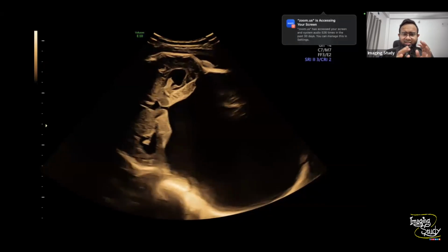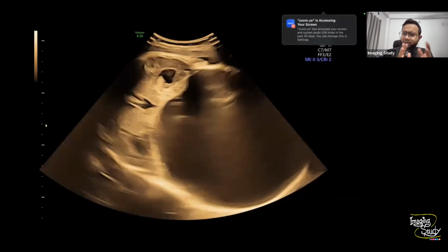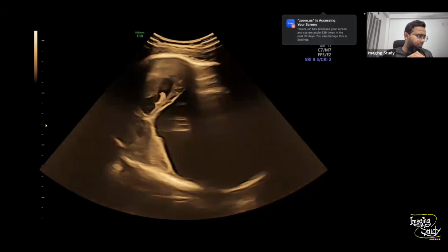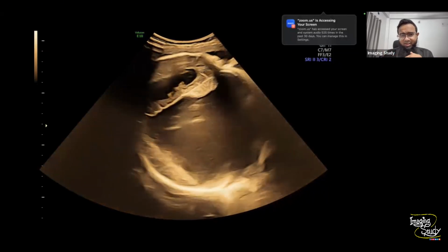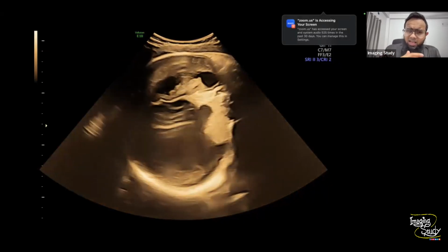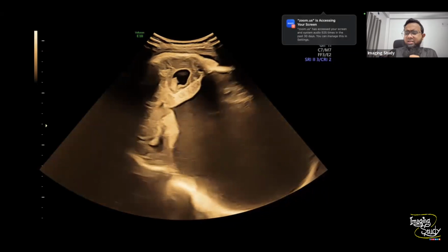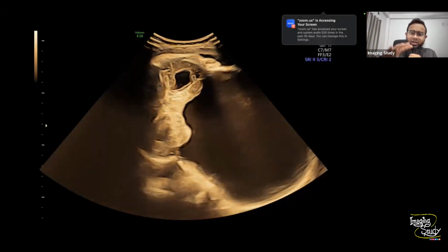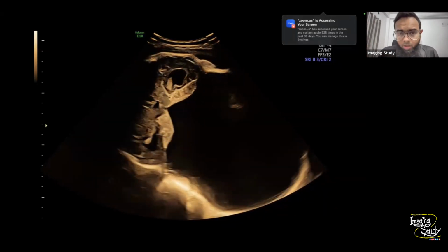Okay, so I asked, are you informed about any head abnormality? She said, yeah, they say there's some abnormality going on. That's okay. She doesn't want to talk about that. So I don't want to inform her about the next one actually. So anyway, I don't know why she was just waiting for this case since the 20 weeks of gestation when it had already been diagnosed.